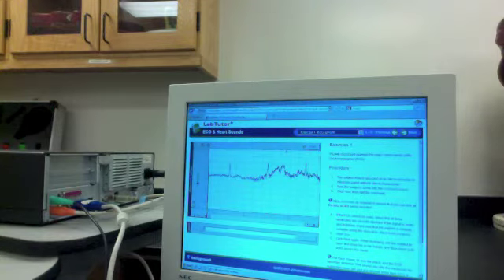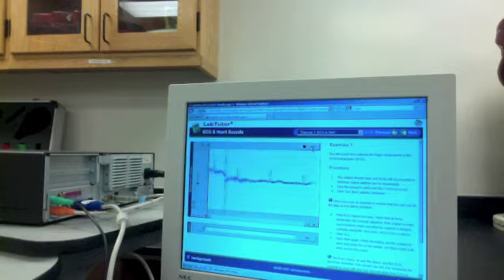It's going to be a little hard for me to do, but I've got everything hooked up. Everything's color-coded. I've got my ground on. And what I'm going to do is hit start here, and hopefully we'll get something, right? And so you can see that you can really nicely see the QRS wave, which is that big spike. And you can see the T, which comes after it. We'll talk about this in class a little bit eventually. And you can see my heart rate is elevated a little bit.